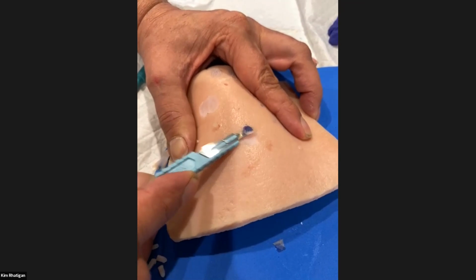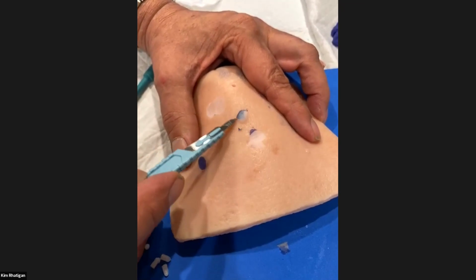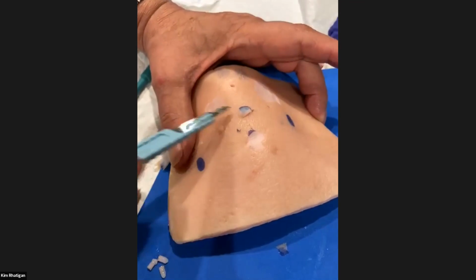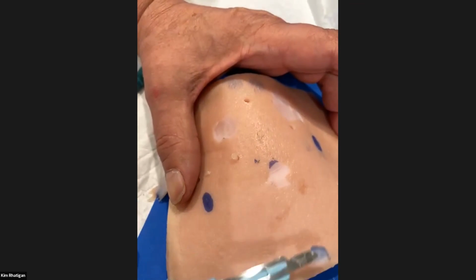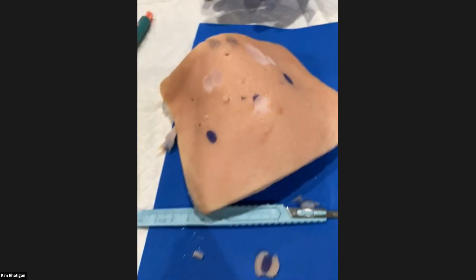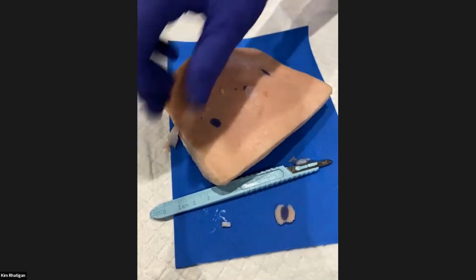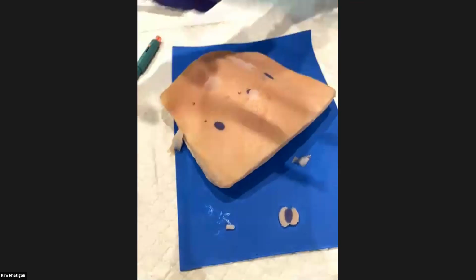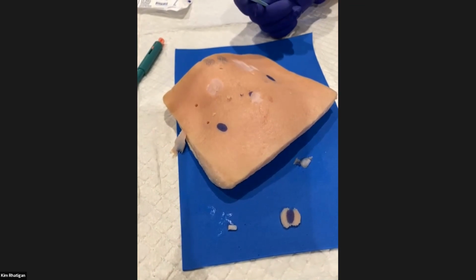Whoops, there it is. So you can actually see the blue through this. I don't know if you can see it there. Your goal is to minimize the amount of dermal scar, because the more dermal damage, the thicker the scar, the more noticeable the scar. On the face, for a solar keratosis or something, they literally just shave the epidermis off.